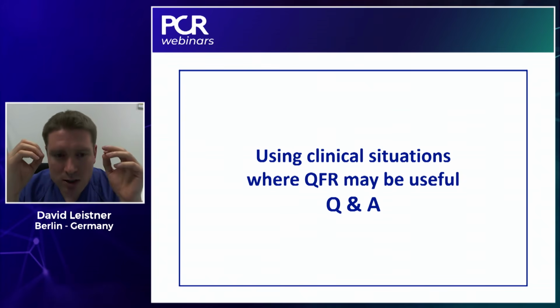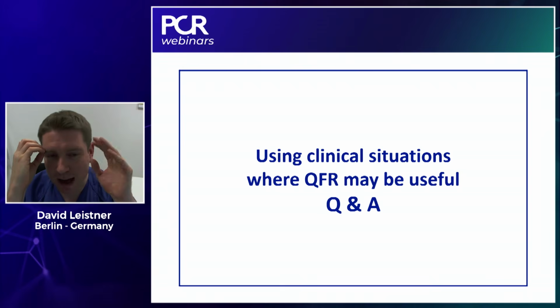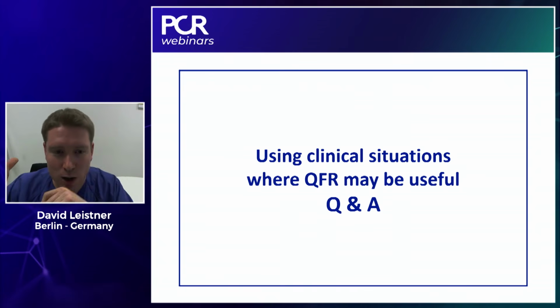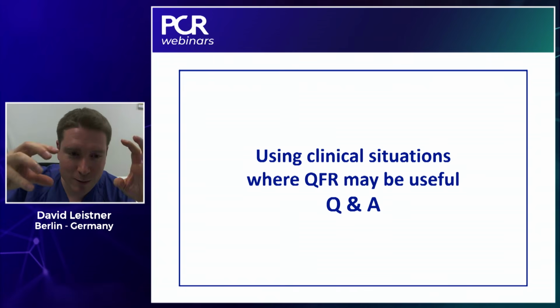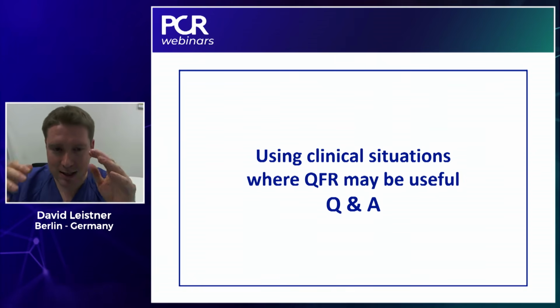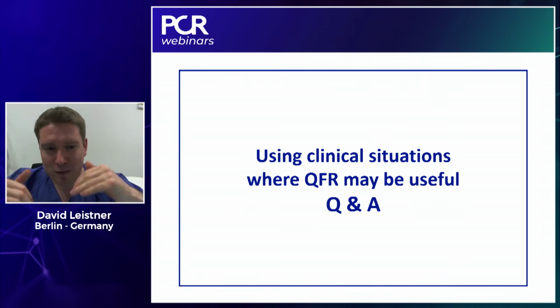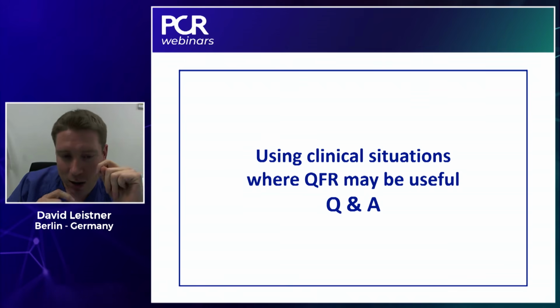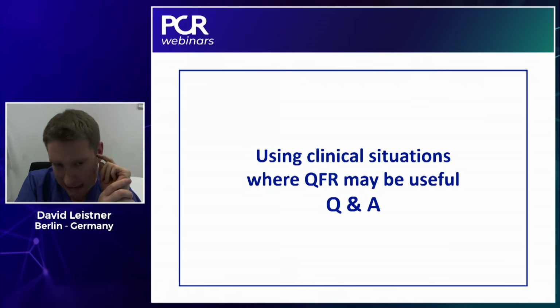I think it's not so important, because every one of you knows that the FFR is also not 100% clear. The FFR was validated against non-invasive ischemic testing. So we now have an evaluation of a new system comparing something which is validated to something non-invasive. So it's also not the 100% solution in my personal opinion.